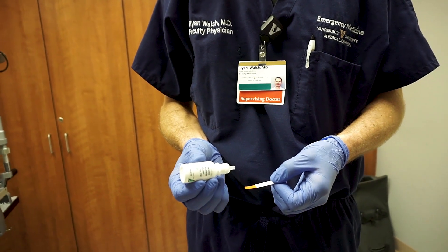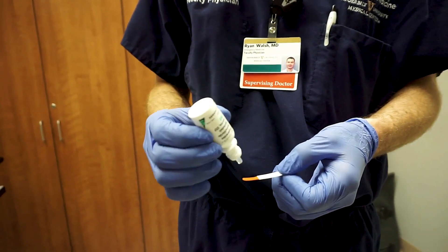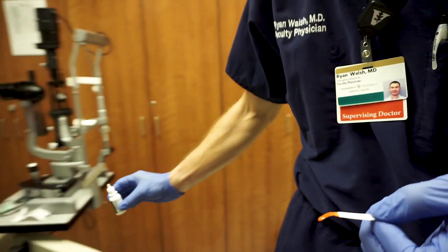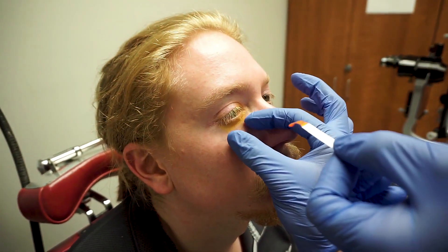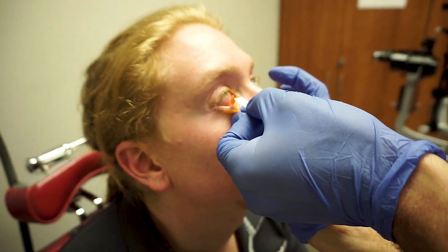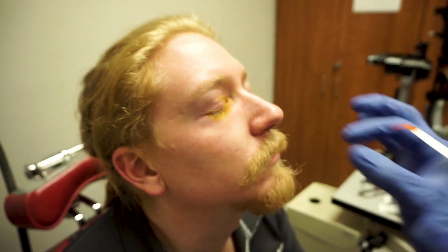To apply fluorescein, add a single drop of anesthetic or saline to the tip of the fluorescein strip.